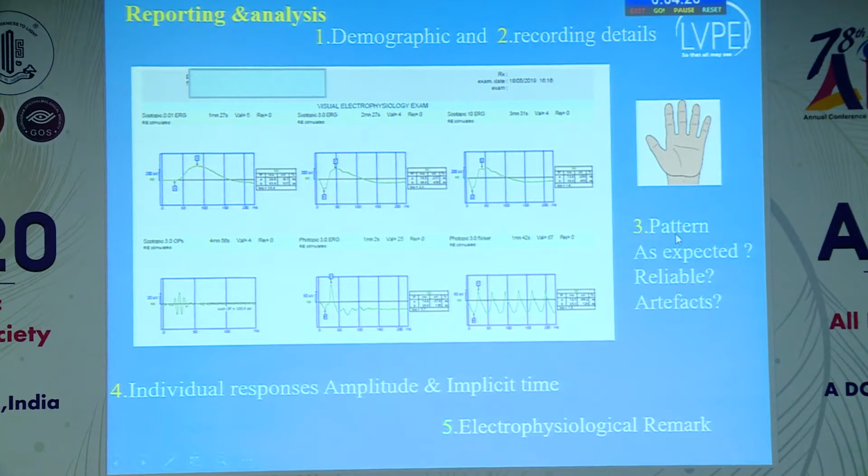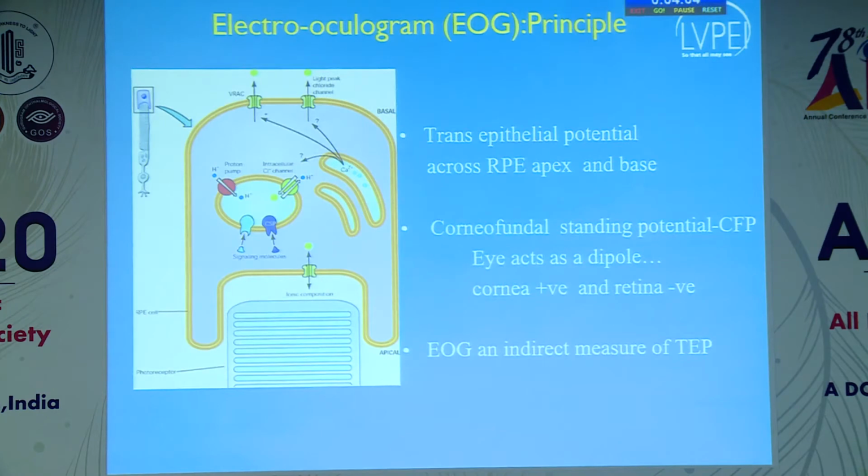Then the patterns: are they preserved? Do they follow what is expected, and are there any artifacts? Finally, individual responses should be measured in terms of amplitude and latency and compared with the normative data for that laboratory and for that setup. Finally, the electrophysiologist's remark.